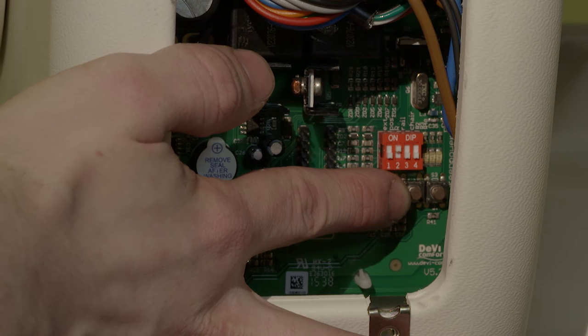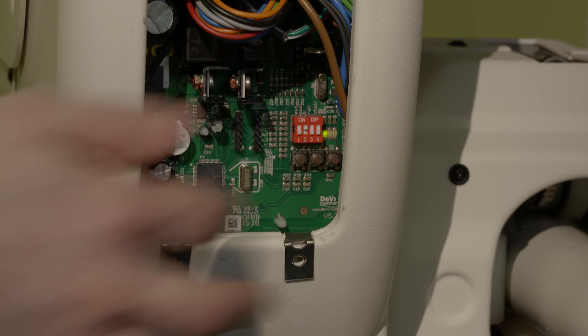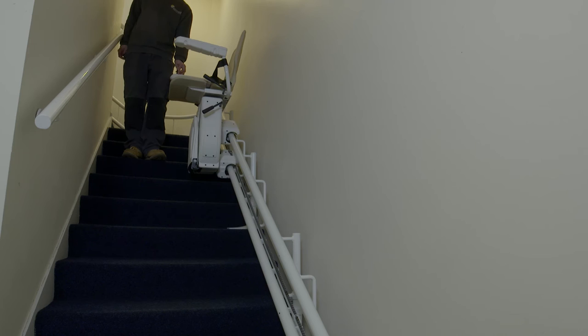Before switching on the stairlift, press and hold microswitch 1 and then turn on the unit. Continue holding until the board stops flashing.